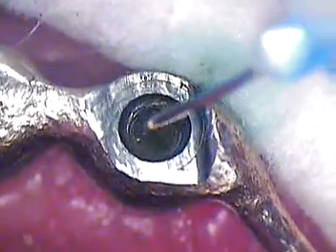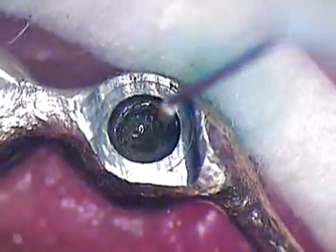We've got another screw that needs to go in there. So we will just hand tighten that, because all these occlusal screws are just hand tightened. Let's just notice while we're soaking, I'm noticing if there's any aberrations, and it's slight on the internal aspect of this rim. But hand tightening is not going to cause any trouble as long as you can gain access. Yep, at 15 newton centimeters, Robert just informed me, or less. So no ratchets, just hand tightening, all right? Okay, very good. Now we just suction that out.